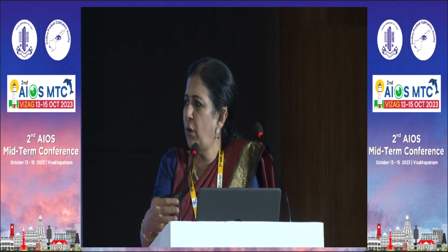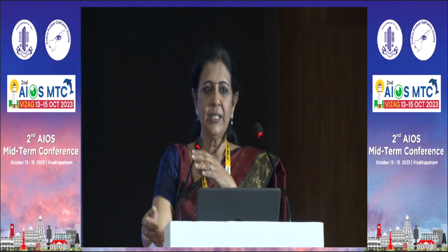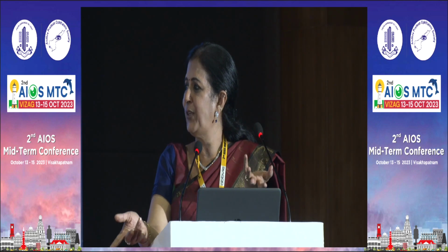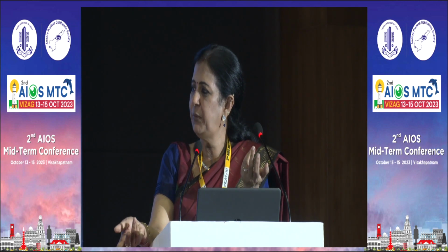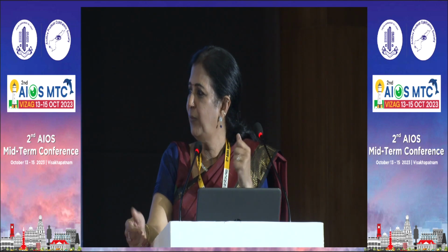We do look at ocular dominance. And although there are a lot of talks, I'm sure Gaurav was also there at ESRS, where they say that ocular dominance is not exactly important at all. But just like that, we go ahead and do it because we have to choose one against the other. So what are your thoughts on it?